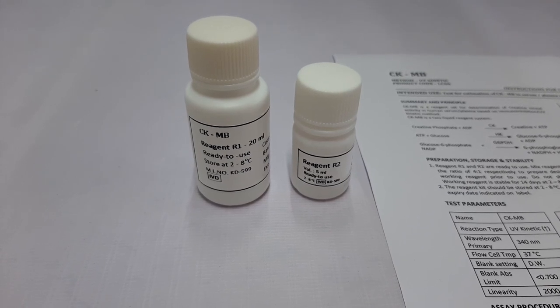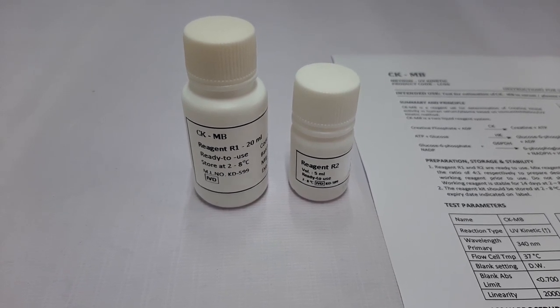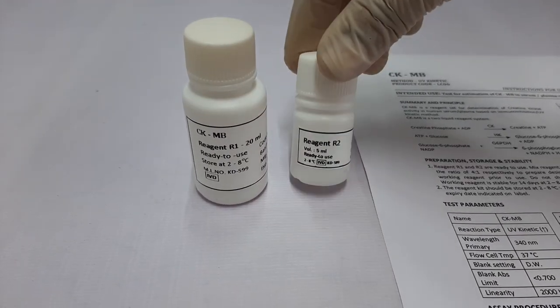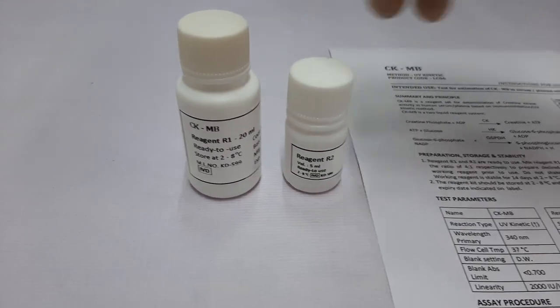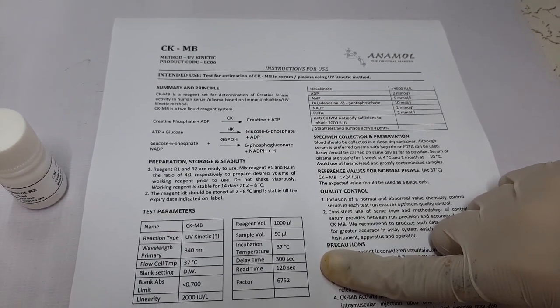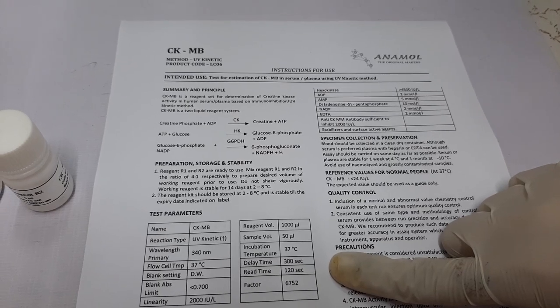First, let's have a look at the kit components. The kit contains one bottle of CKMB-R1 reagent, one bottle of CKMB-R2 reagent, and the instructions for use. We recommend all users to read the instructions for use thoroughly before using the test.